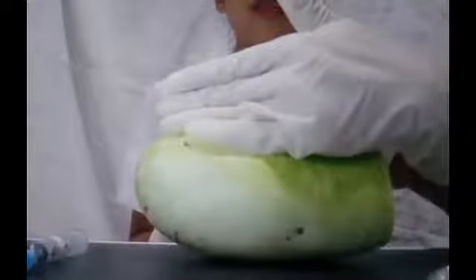So first let's alcohol it off, and when we use the Z-track method, we're going to use our hand to move the skin like this, while the other hand holds the needle.